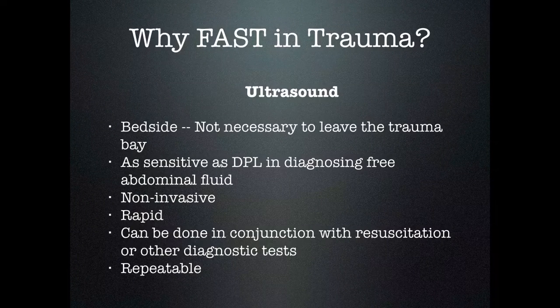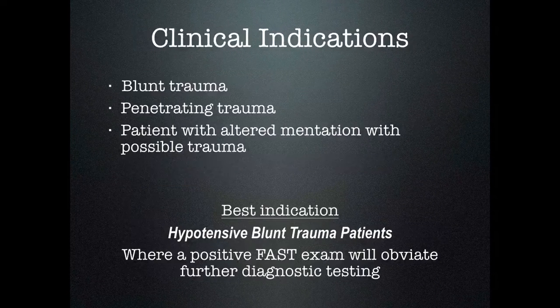Ultrasound, in contrast, is done at the bedside, so it is not necessary to leave the trauma bay. It's as sensitive as DPL in diagnosing free fluid, but it's non-invasive. It's also rapid, can be done in less than a minute, and can be done in conjunction with other resuscitation or other diagnostic tests. Further, it's repeatable, so if the patient's condition changes, if the patient becomes hypotensive, you can repeat it to see if the patient now has free abdominal fluid or bleeding into their abdomen.